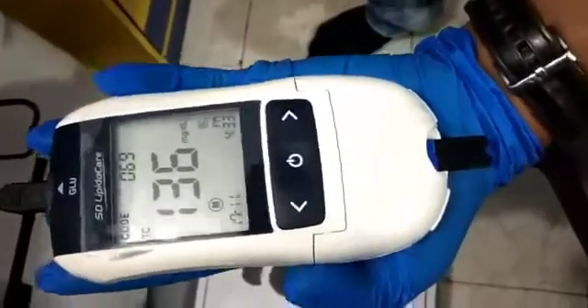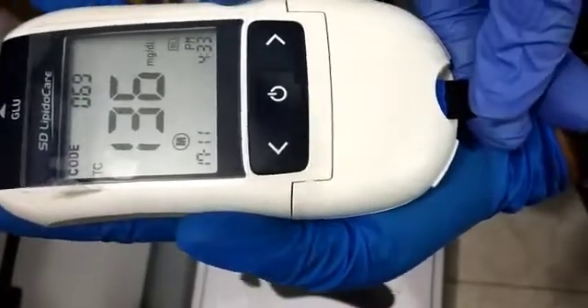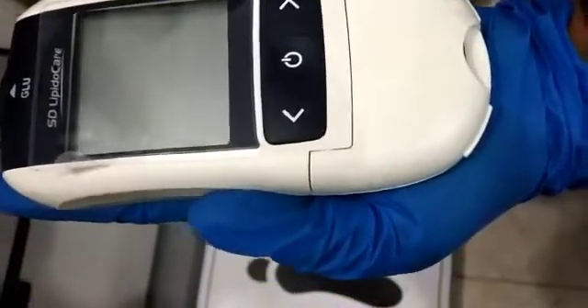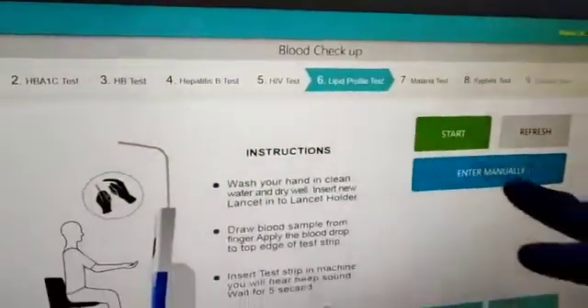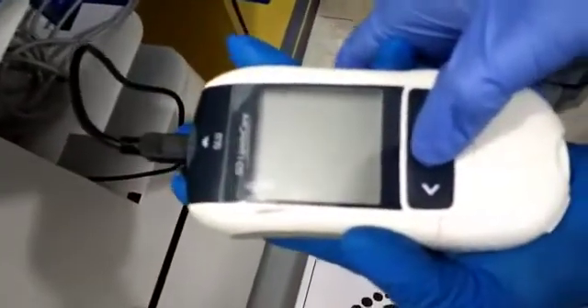To get data on the screen, we just have to first remove this strip. Now it will get off. On the screen we have to press the start button — now on the machine, press once.